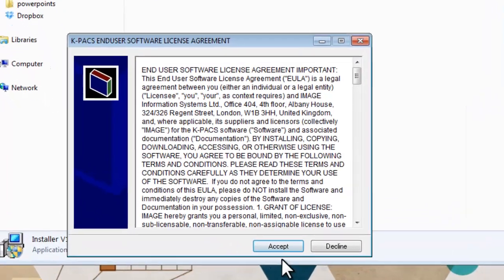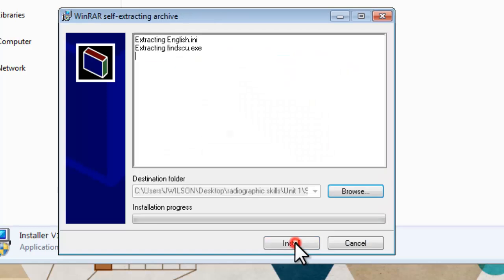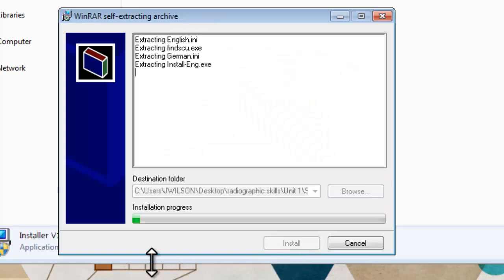So you accept the terms of the software, and you watch the software being installed.